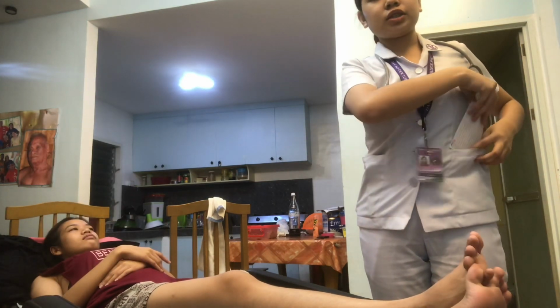For this assessment, we'll be needing a rectangular card and a ruler to measure our jugular venous pressure. Next is our penlight as a tangential light source. And lastly, our stethoscope to auscultate heart sounds. So prior to conducting this assessment, rest assured that I already performed hand washing and cleaned and sanitized myself before meeting the client to prevent cross-contamination.